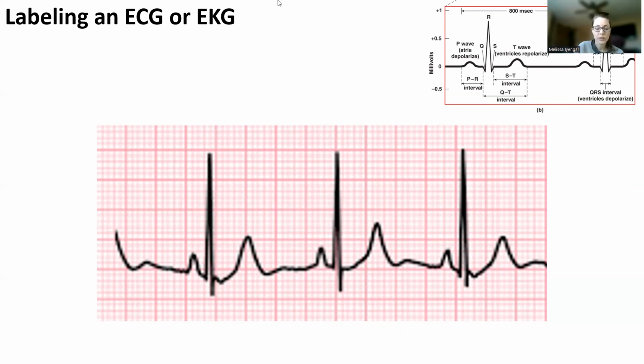As a healthcare provider, you would hook up your patient to the machine, which runs for several minutes to register what is happening to your patient's heart. Do they have any problems not just with the electrical patterns in their heart, but with their actual cardiac cycle and how they're moving blood through their heart? The ECG can tell us all those things.